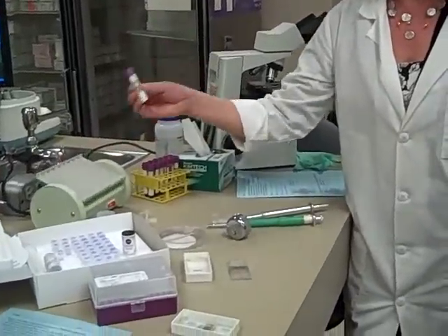Today we're going to be performing manual white counts and we're going to be using whole blood EDTA, well mixed. It's very important to have a good aliquot.